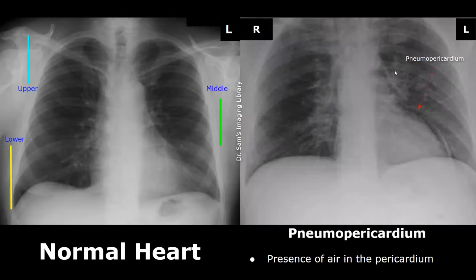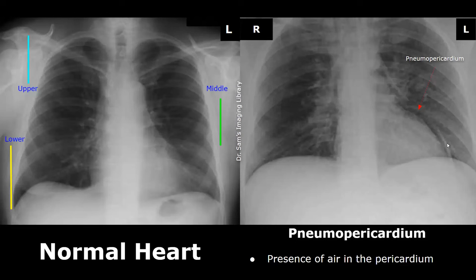Pneumopericardium refers to the presence of air in the pericardium. On X-ray it will appear as a radiolucent or dark area surrounding the heart, and this dark area will be surrounded by a thin bright or radio-opaque line — that is the pericardium. The dark area is the air, and this is a feature of pneumopericardium.